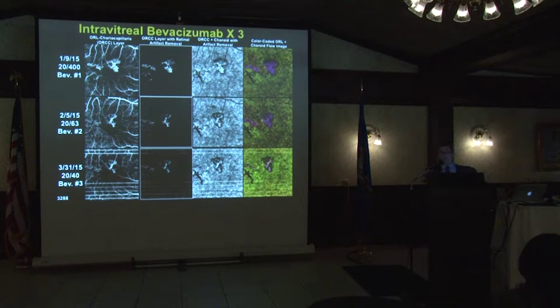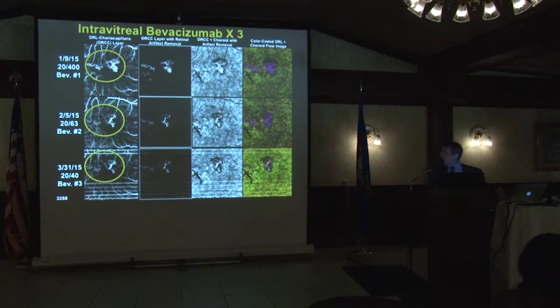But they don't go away, and that's a central theme with OCT angiography. These neovascular membranes are not going away. We're just controlling the exudation. So this patient ended up doing well, but unfortunately moved out of the area after this visit.